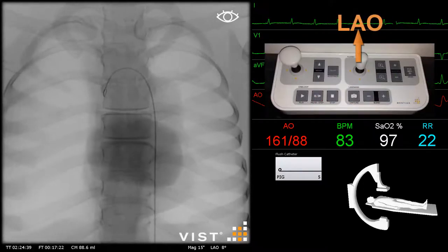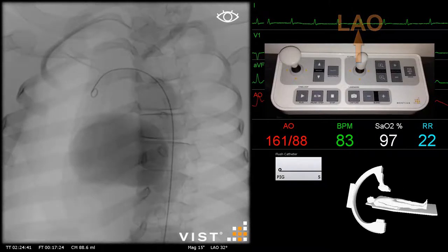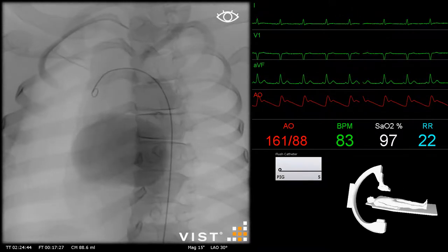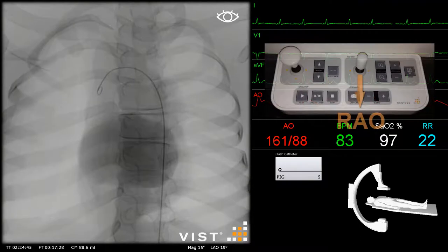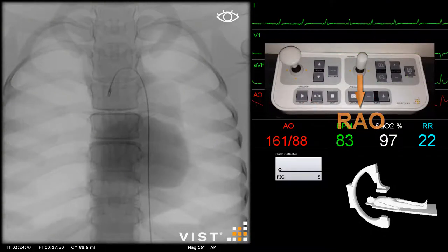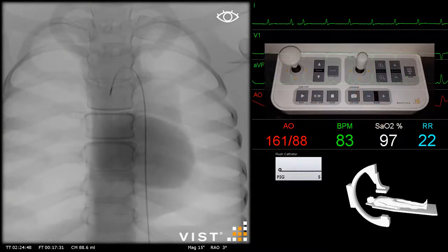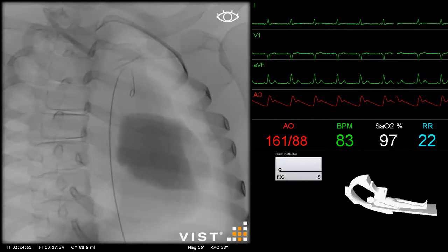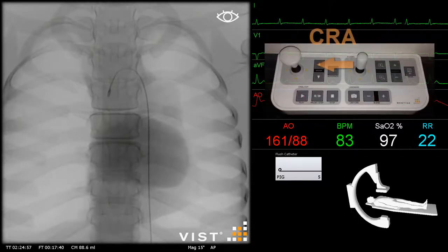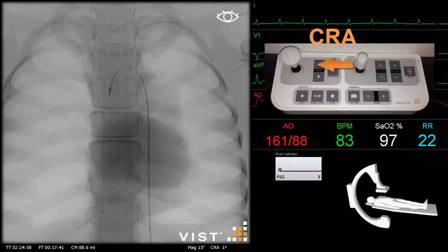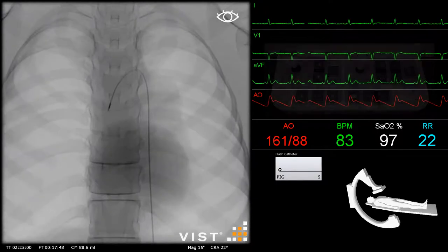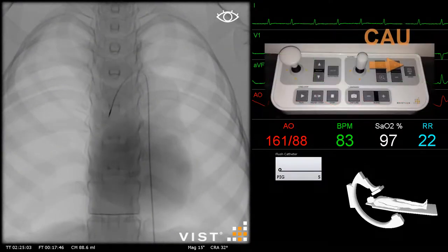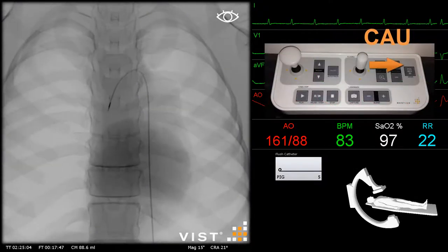By moving the right joystick up, we are going in the LAO direction, and by moving the right joystick down, we are going into the RAO direction. Moving the right joystick to the left takes us into the cranial direction, and by moving the right joystick to the right, we are going into the caudal direction.